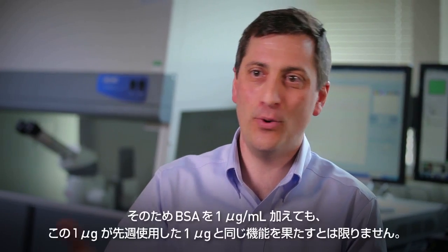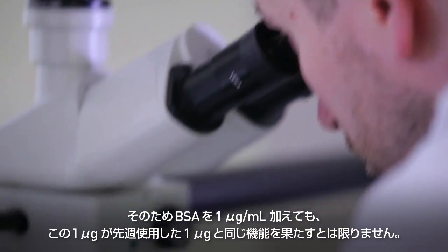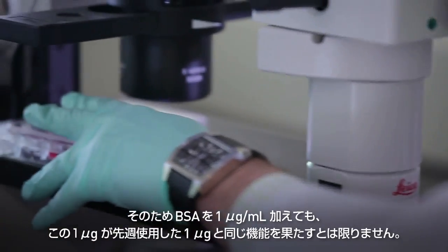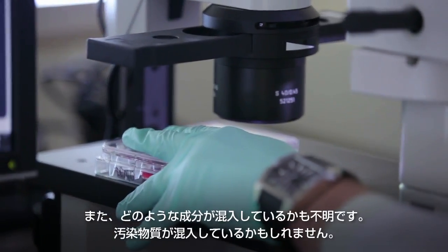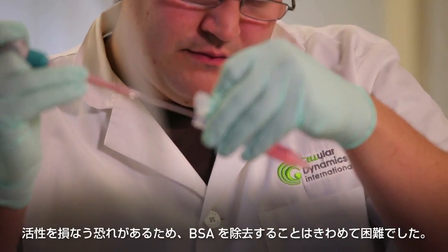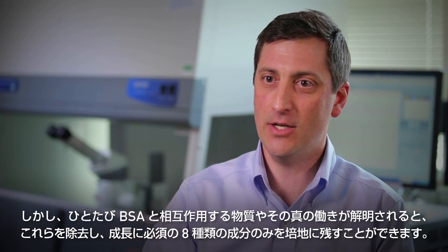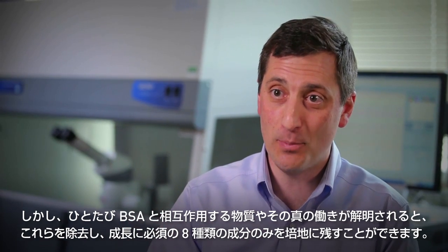There is no clear test you can perform to see what the biological activity of BSA is. So you put in 1 microgram per mil of BSA, but you don't know whether that 1 microgram has the same intrinsic function as the 1 microgram you put in last week. And then you don't know what else it's carrying in with it, what other hitchhikers. It's very hard to delete it because of its activity, but once you figure out what it's interacting with and what its real job is, and you can strip that media down to 8 essential components, you don't need it anymore.